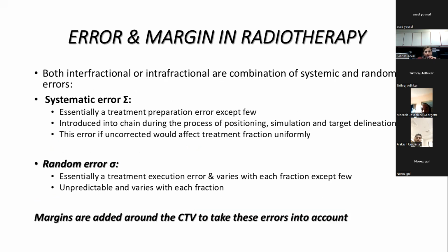This error comes into the chain during the process of simulation, when we are positioning the patient, when we are delineating the volume, or during the radiation planning process.